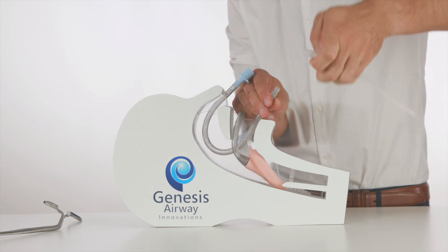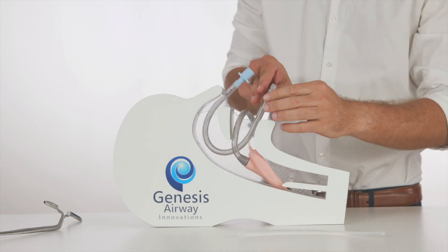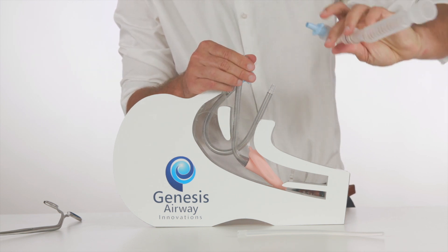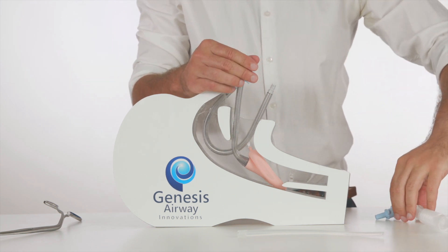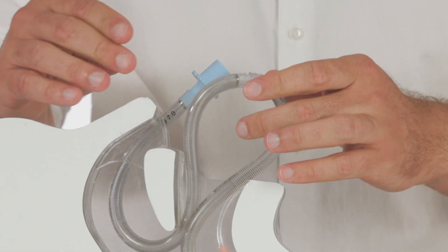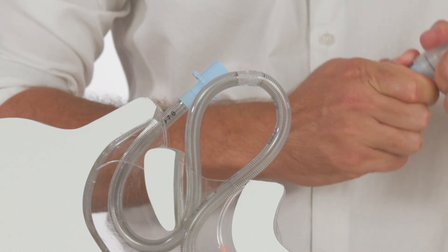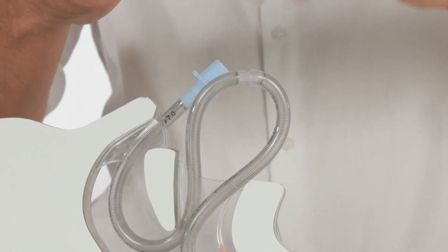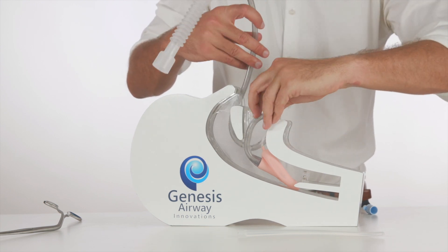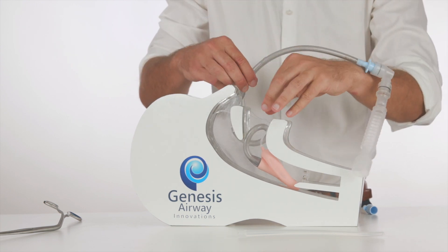The anaesthetic circuit is then also removed from the LMA, taking with it the 15mm connector, and the LMA tubing is joined to the airway tubing as shown. The patient can then again be ventilated and the airway tubing is gently fed back into the mouth as it is retracted through the nose until the connection is present outside the nose.